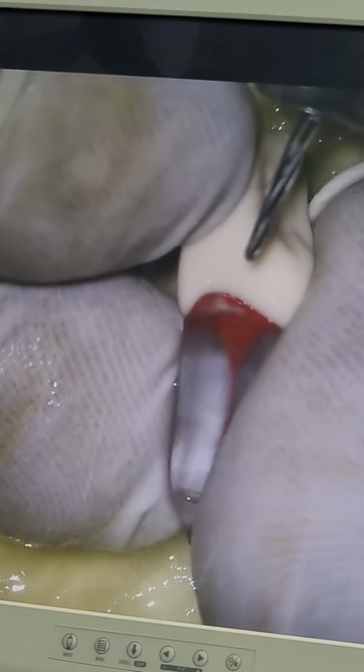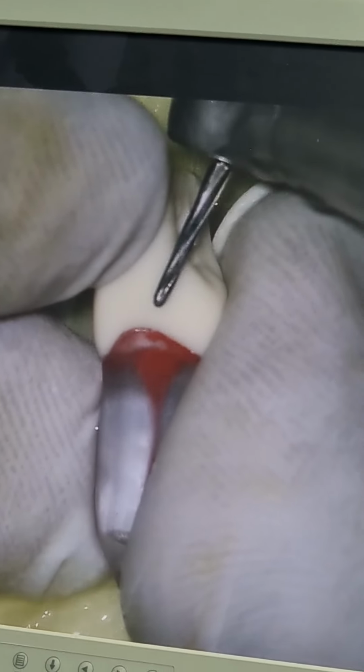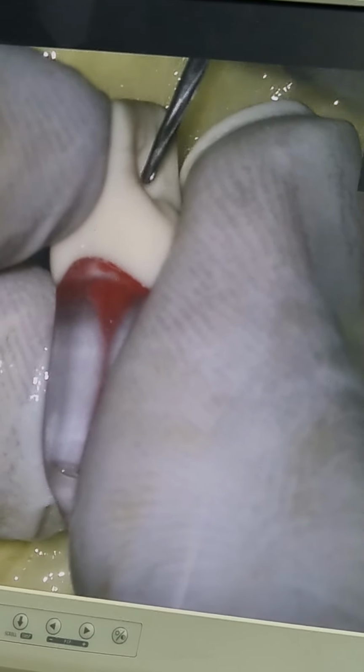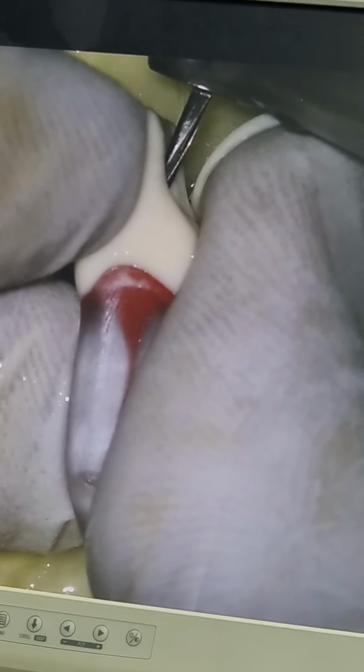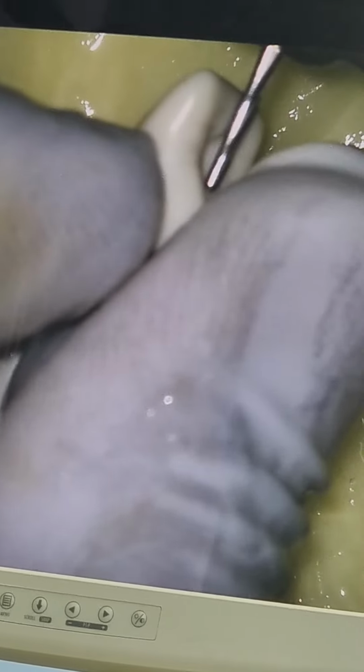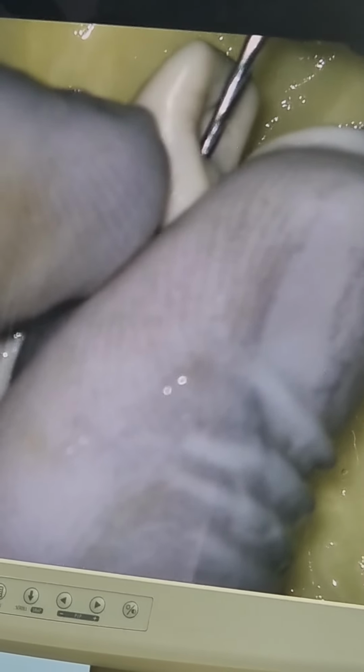So the usage is the same, parallel to the long axis. Tip of the burr toward the center, with a slight lingual tip. This is the burr where students tend to make a mistake. What mistake? They will keep it straight, and when you keep it straight, it will rub against the incisal edge and cut the incisal edge. So you have to give a slight lingual tip.